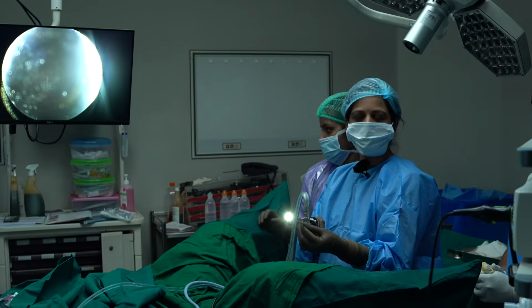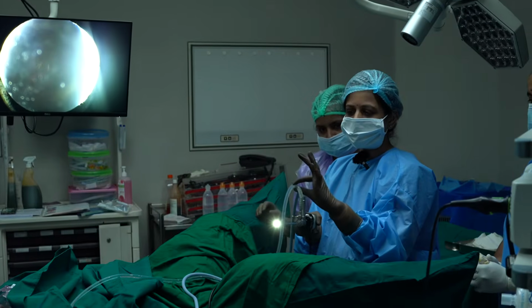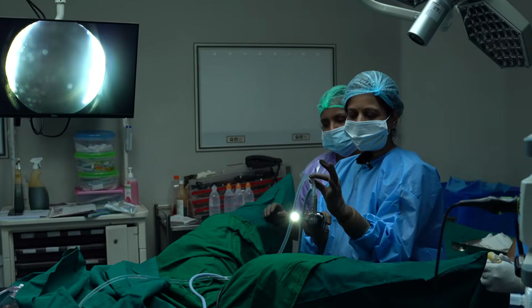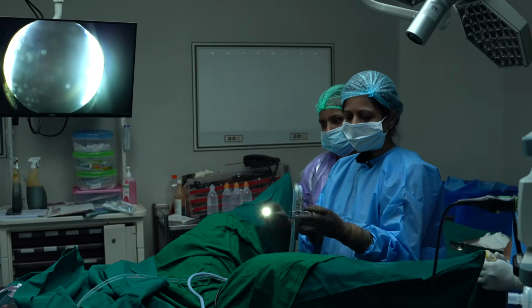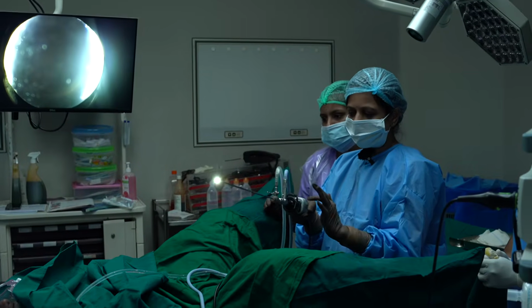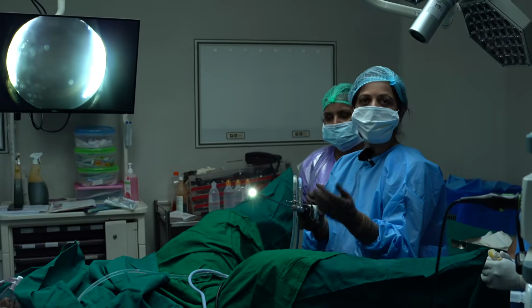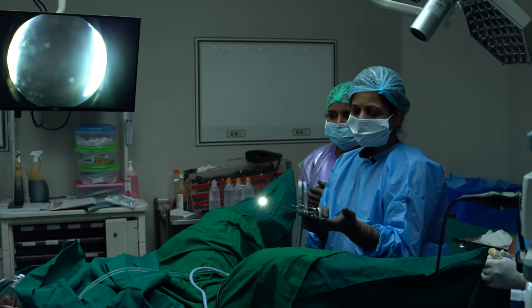This is the 2.9 millimeter hysteroscope, where you can see that there is a connection for the saline, that is the normal saline, which is a liquid that will go into the uterine cavity. This is the camera head, and this is the light source where we can illuminate the uterine cavity to check. When do we do this procedure?